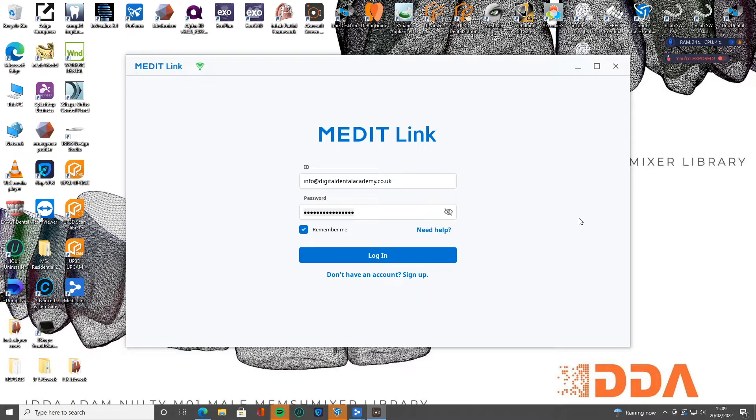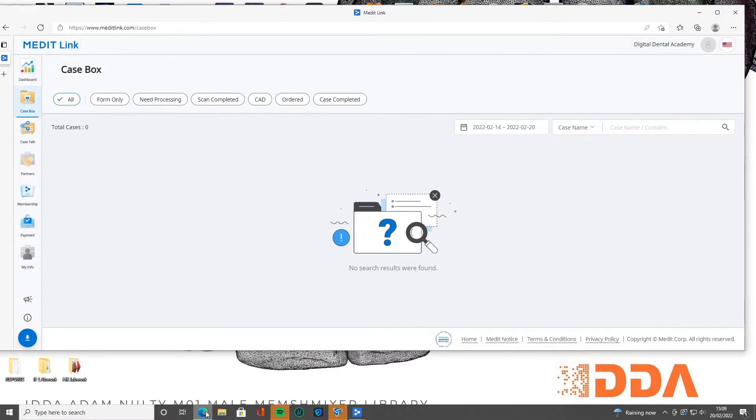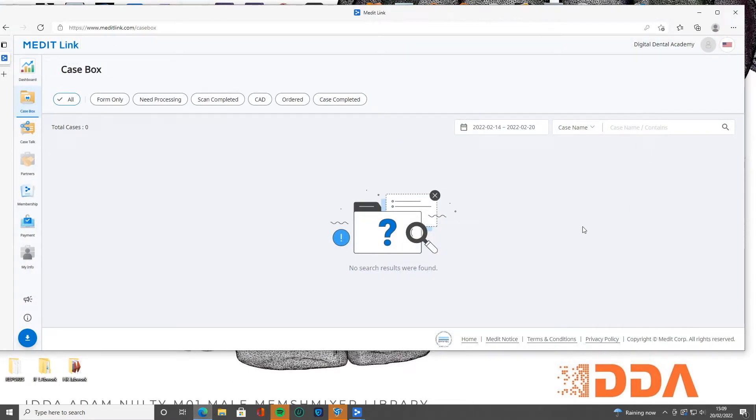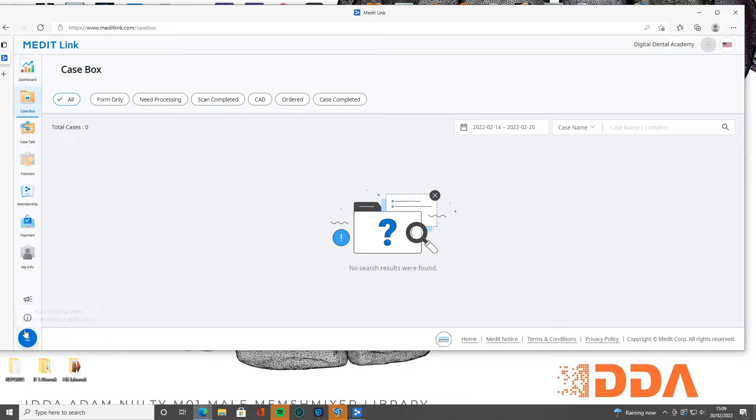So let's get started. First things first, when you get going with your scanner that you've been delivered, whether it be an i500, i700, first thing you want to do is we're going to go to MeditLink.com. You'll register there, you'll log this in. Once you've registered and logged in, you'll see on the bottom left here we have this little blue icon.